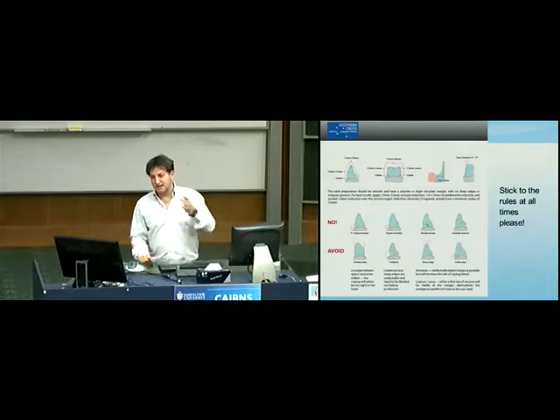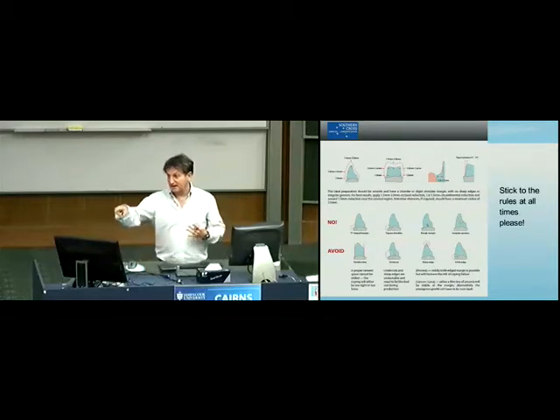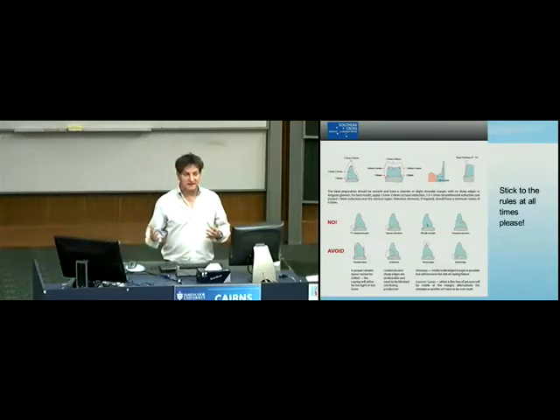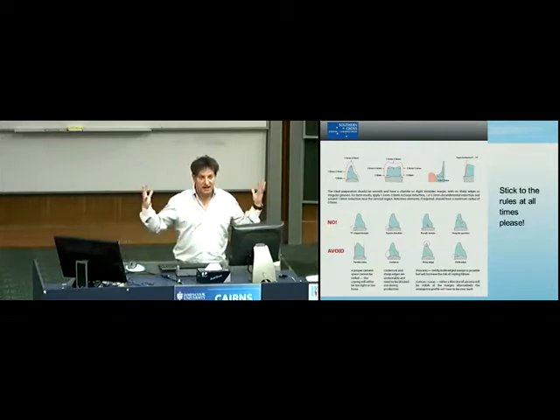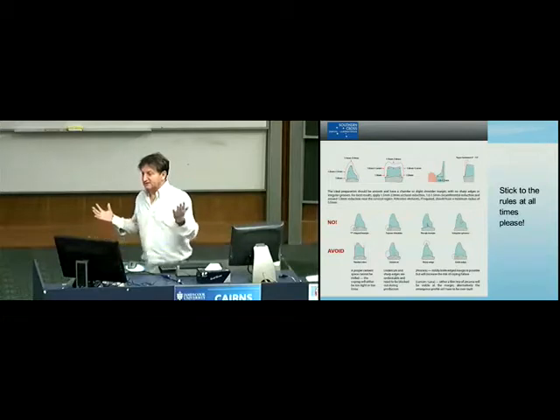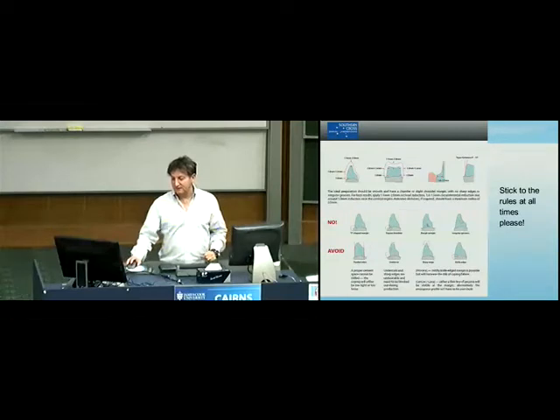I think that Dr. Sharp, Albert, who works with me in the laboratory, the other day he showed me a scan. We're getting some people using intraoral scanners now. And we were hoping the fact that because the dentist could actually see these scans on the screen, the quality of the preparations would get better. But guess what? They're taking scans now of underprepared teeth. They've spent $40,000 buying this thing, and we've still got a preparation which is not quite right. So please, if you can, stick to the rules where you possibly can at all times.